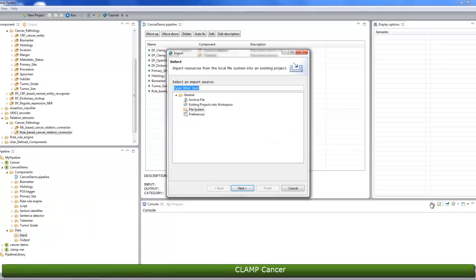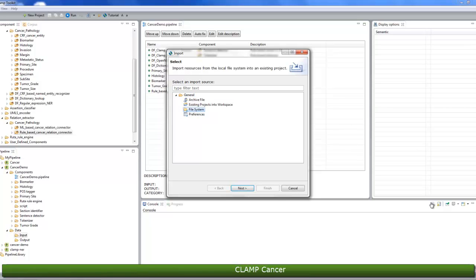A pop-up menu will appear, which lets you select the files that you want to import. Click on the small arrow next to the general folder to expand it, and then select File System as the import source. Then, click on the Next button.